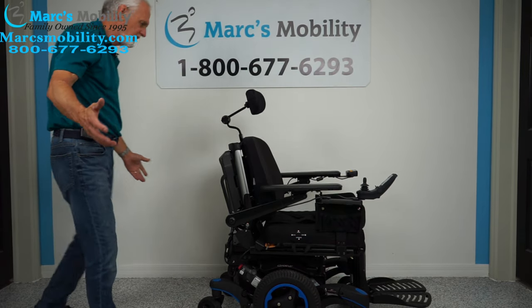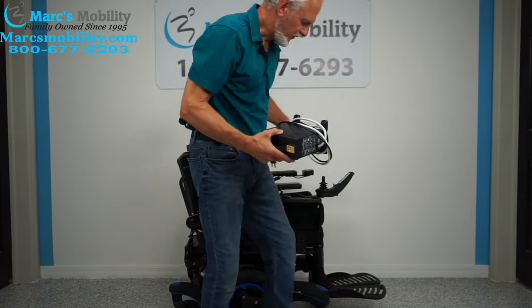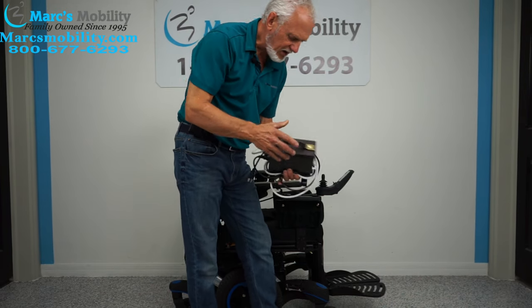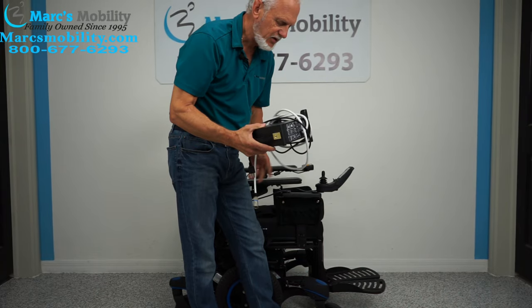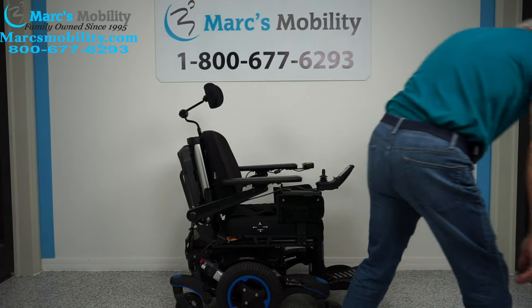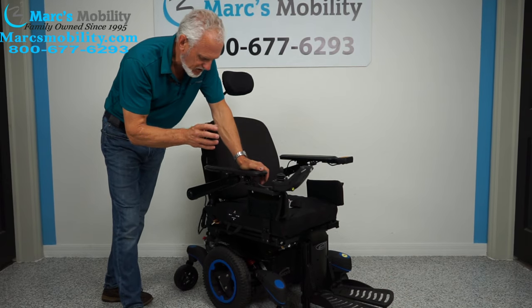To charge this chair, plug your charger below the joystick. When the light on the charger changes from orange to green, it means the batteries are full and the charger will stop automatically.